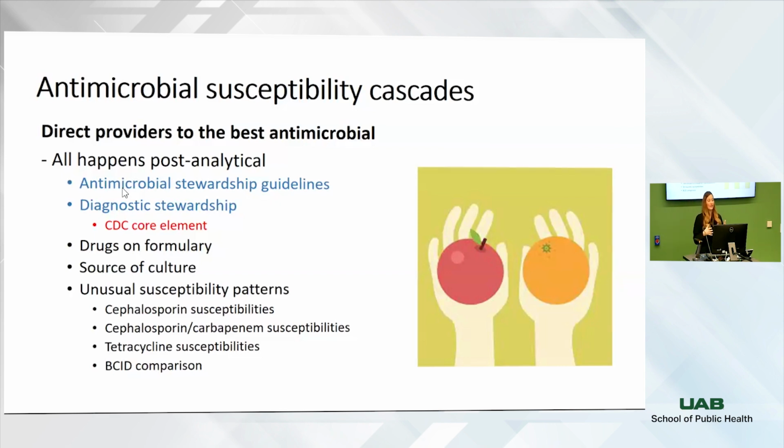And tetracyclines, that class of antimicrobials, also have similar rules. This allows us to backtrack our results in the lab, but also allows us to monitor increasing unusual antimicrobial resistance trends within our population at UAB that we might not be aware of if we weren't routinely monitoring those.